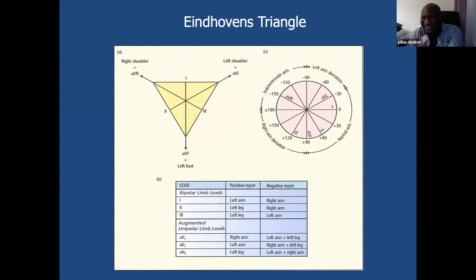But I know St. Jude, I think it came from St. Jude actually. Is that right, AJ? When you're doing 12-lead ECG pacing, LV, RV pacing, to change the 12-lead to see if you can actually optimize biventricular pacing based on whether the QRS is narrowing.